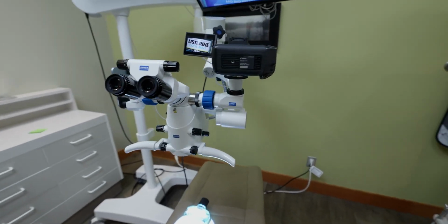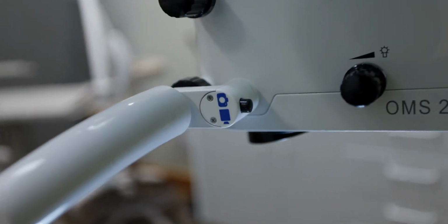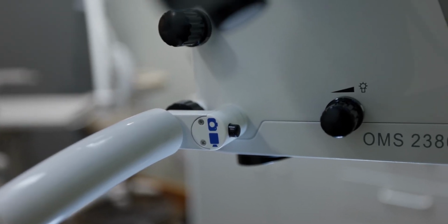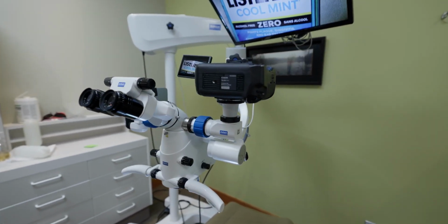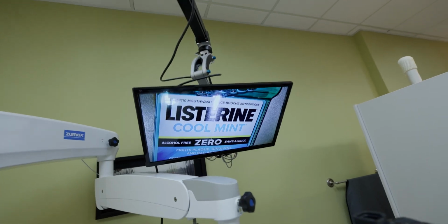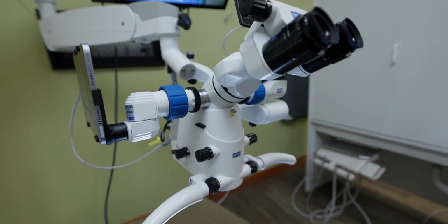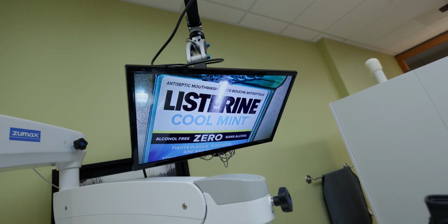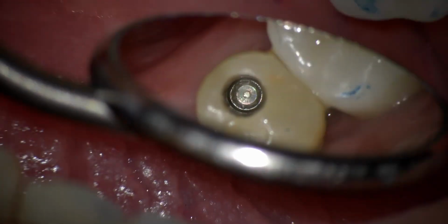But now there are internal recording options which are frankly incredible. So if you look closely, you'll see this little trigger. If you hold that for a second, it'll take a photo. And if you hold that for 3 seconds, it'll start taking a video. And I was skeptical. You know, I've been a stickler about video quality for a long time. But I have to say, the images coming out of this, and which is, by the way, this is what you're seeing on the screen right now. That's a live feed from the internal camera, which is a Sony sensor, I believe, inside the scope. That is outputting only 1080p to the screen, but it's actually recording 4K. And I'm going to show you some sample footage here of what the 4K footage actually looks like.